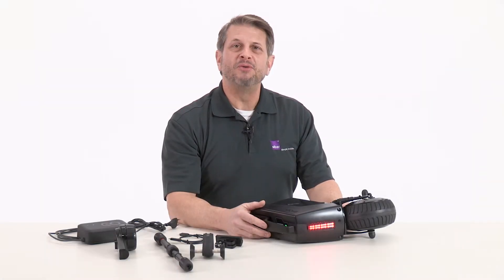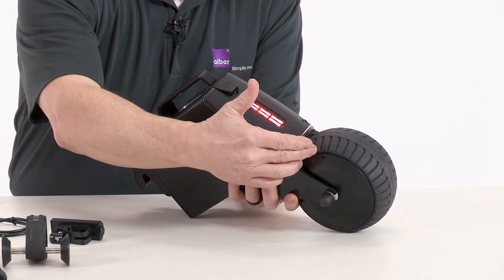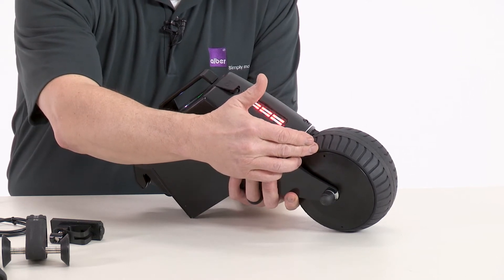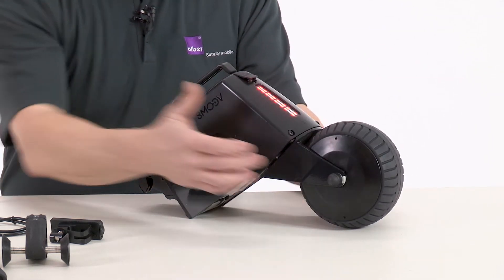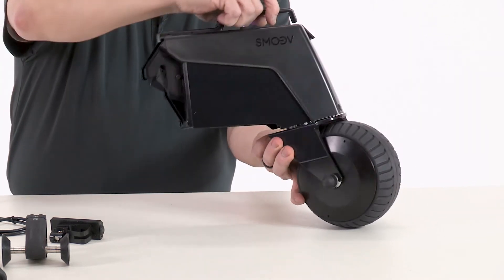Let's talk about the star of the show, the SMOOV one Drive Unit. We've packed a lot of power into something that weighs less than 16 pounds. Here's a few of the key components. The SMOOV Drive Unit comes with a wide rubber tire for good traction, a powerful 250-watt hub-mounted motor, and a swiveling rear wheel.